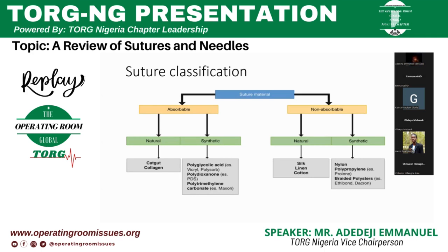And by the 3rd week, it can still retain its 50%. So that is what polyglactin 910 has provided. And of course, that's superior over every other suture that falls into the category of synthetic absorbable sutures.